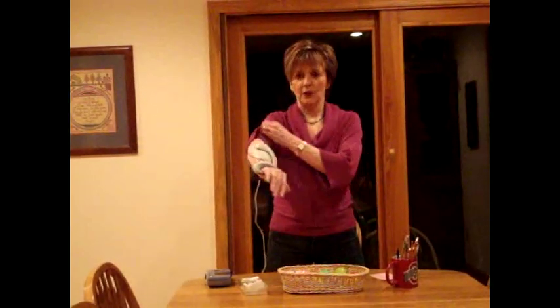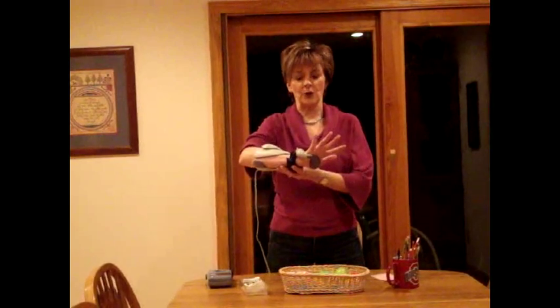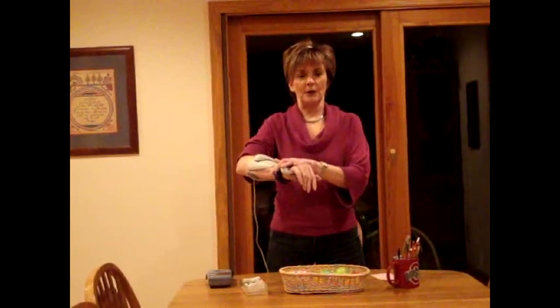The machine I have on is by Bioness, B-I-O-N-E-S-S, and it's called the H200. And this is what did the repetitions for me to get my hand working. I started using this 9 months after my stroke, and I had no wrist and very little finger movement, and I could raise my arm about up to here.